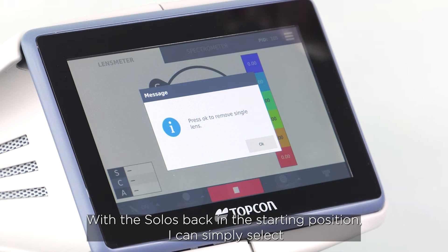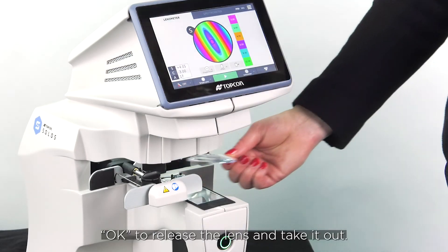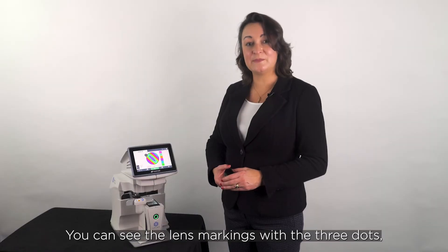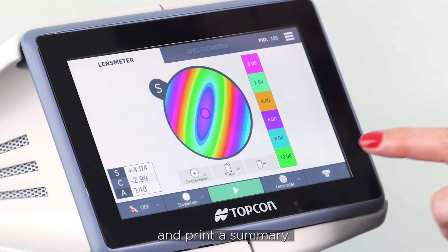With the Solos back in the starting position I can simply select OK to release the lens and take it out. You can see the lens markings with the three dots, and I can review the lens analysis on the screen and print a summary.